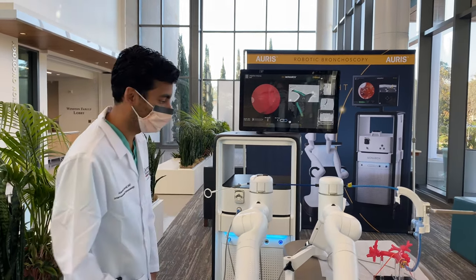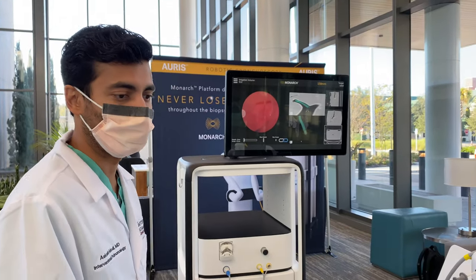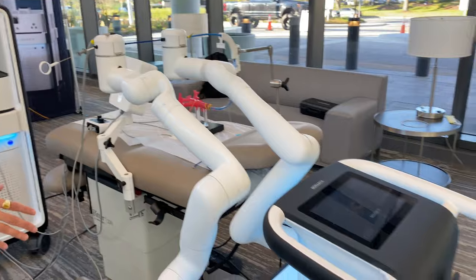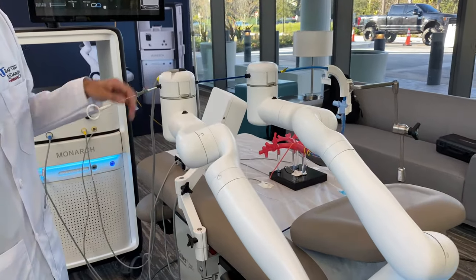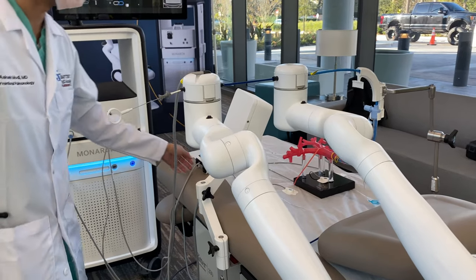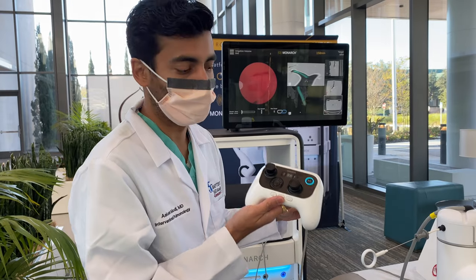Please join me in our demonstration. It starts with a cart, which has the monitor as well as the console. The console comprises of two robotic arms, which helps drive the bronchoscope. I would like to emphasize here that the robot helps drive the bronchoscope. However, it is controlled via a controller that is held by the provider.